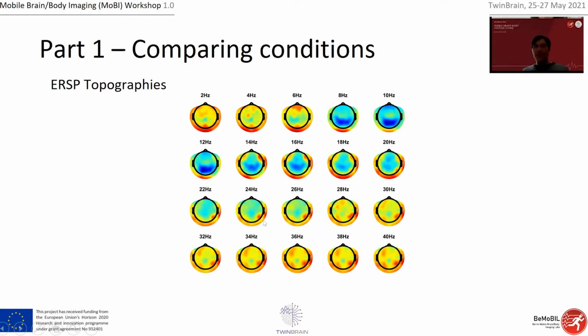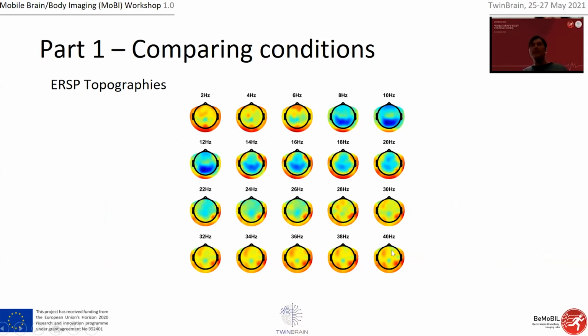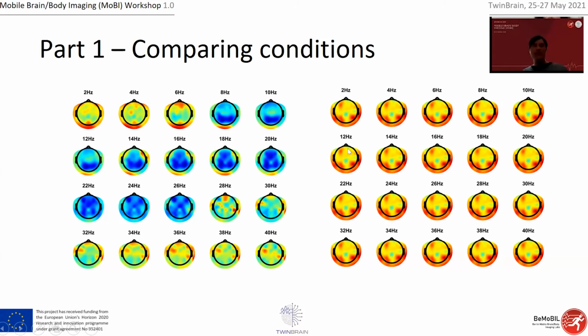So we start with the raw ones, and we can split up these raw topographies into two parts. This is the raw one, these are the corrected ones, meaning the good ones, and this is the frequency-dependent topography for this bad component. It's per definition always the same because it's always the same pattern. If you look at the raw data, we see it's the same, and then we just remove one specific pattern, which of course is always the same but varies in strength. Meaning this plus this would result in the original data as well. And that's already the end of the first part.